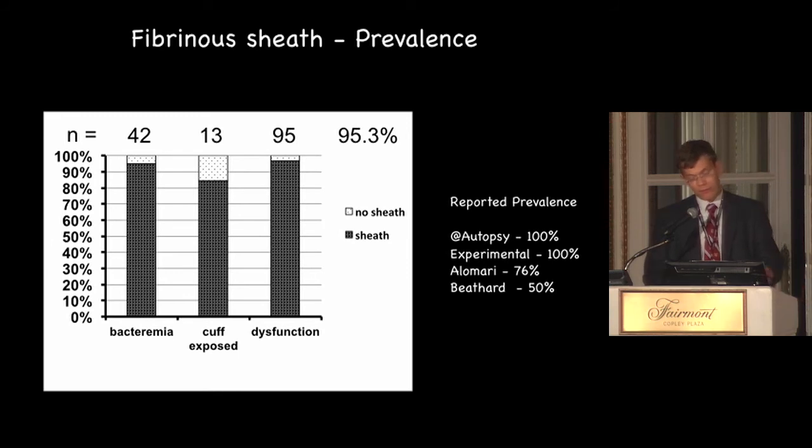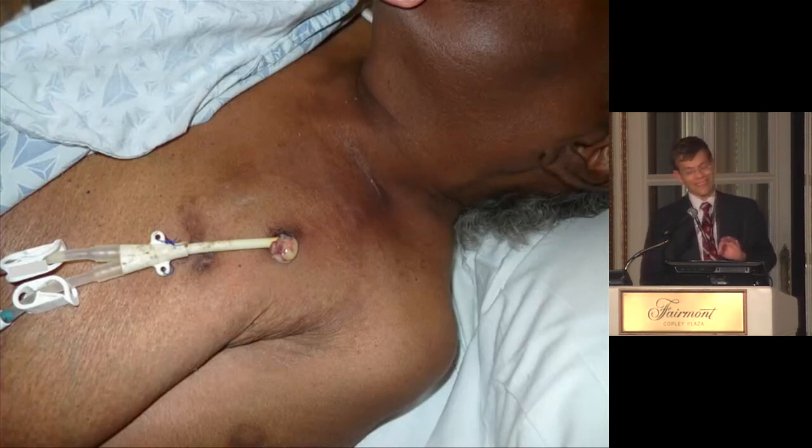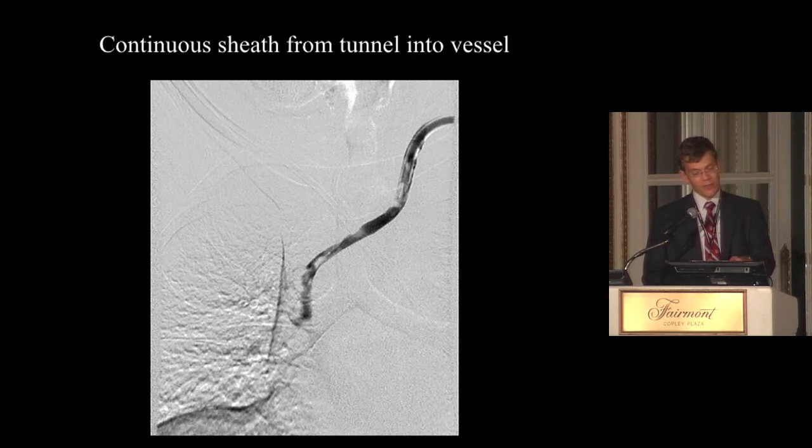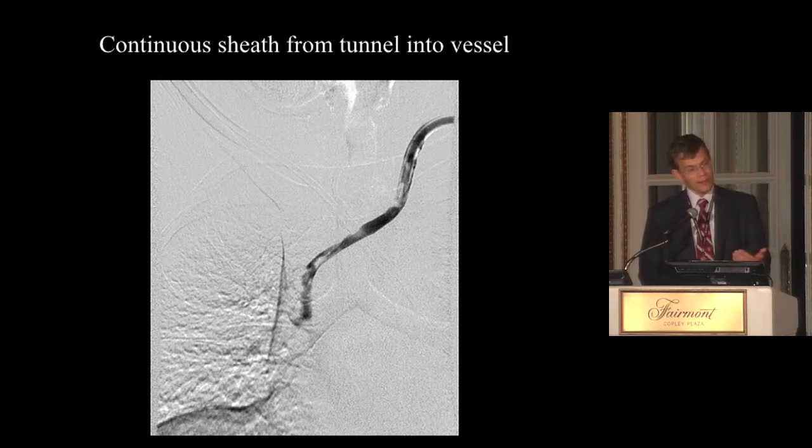Almost all catheters, if you look by autopsy, have this fibrinous sheath. Now, if you think of tunneled catheter infections, the tunnel extends from the skin into that fibrinous sheath inside the vein. So in this patient here, we actually pulled the catheter back, and you see all these concrements in that fibrinous sheath inside the catheter tunnel. And it's easy to envision that this is infectious material. So when you have an infected catheter and you pull out the catheter, you're actually leaving behind, in a sense, a niche in the fibrinous sheath where bacteria can sit. So that's partially the rationale.